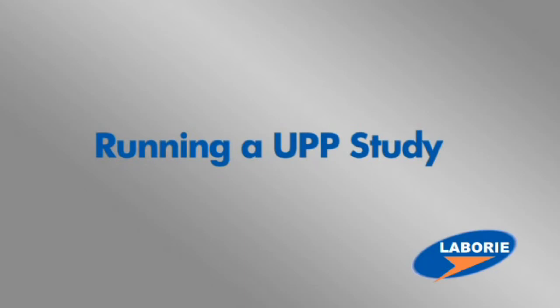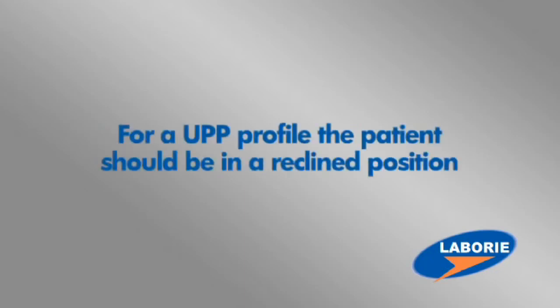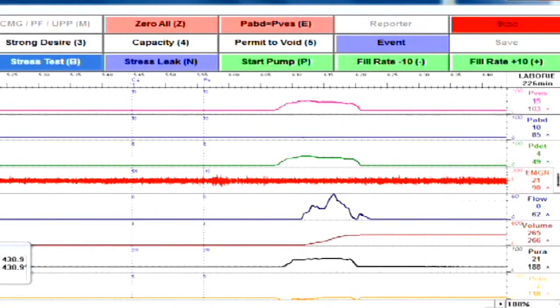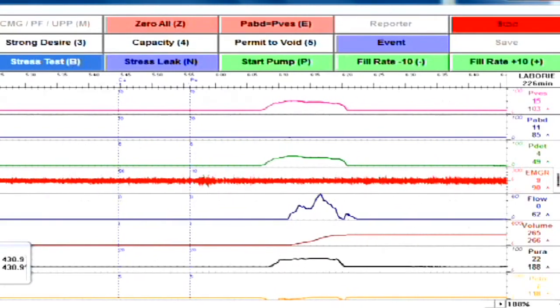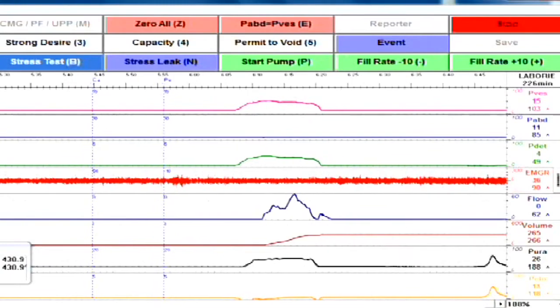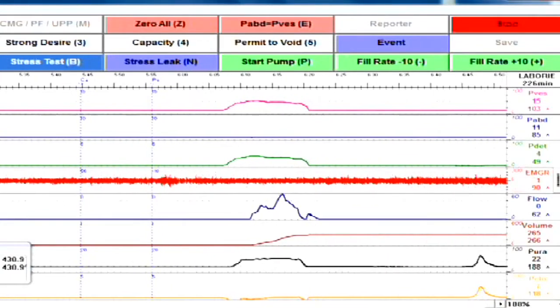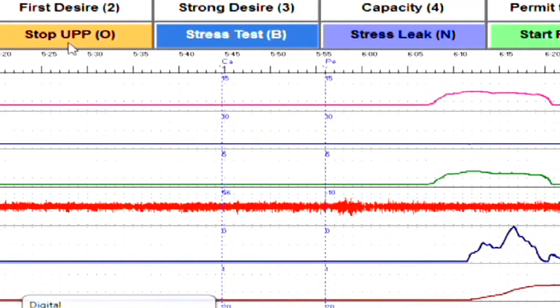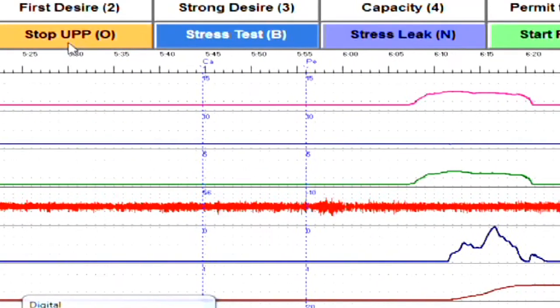For a good urethral pressure profile, the patient will ideally need to be sitting in a reclined position. It's important to note that your P-VESS pressure is still reading properly the pressure in the bladder. You'll need to untape the catheter, and when ready, click on Start UPP. Note that the button flashes, letting you know that the UPP testing is activated.